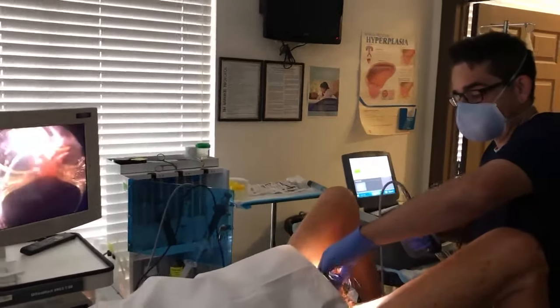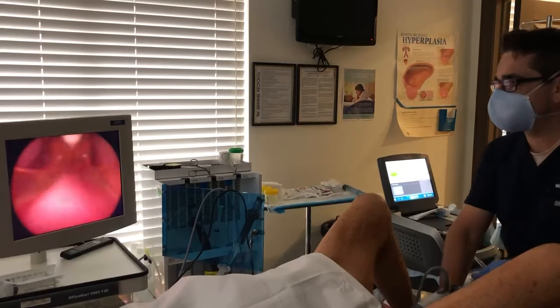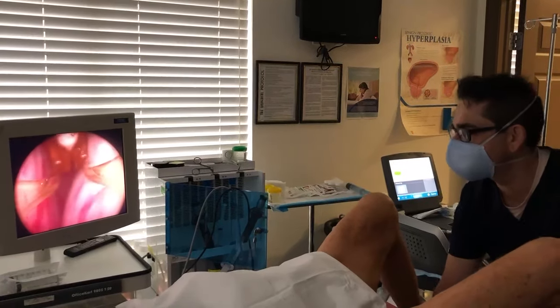Dr. Mike here, we're going to do another Rezum procedure on him. This guy has a 50-gram prostate. You can see he has a very high-riding bladder neck — look at that. We're going to have a hard time getting in here.